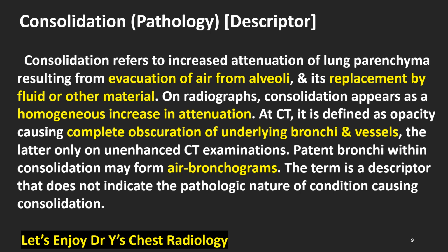Consolidation, pathology descriptor. Consolidation refers to increased attenuation of lung parenchyma resulting from evacuation of air from alveoli and its replacement by fluid or other material. On radiographs, consolidation appears as a homogeneous increase in attenuation.